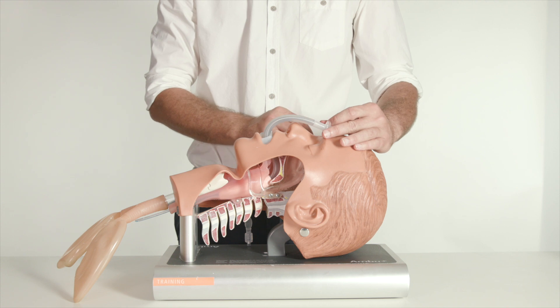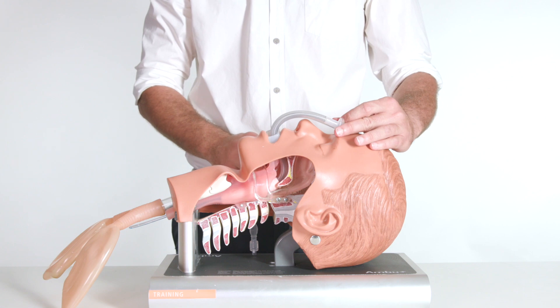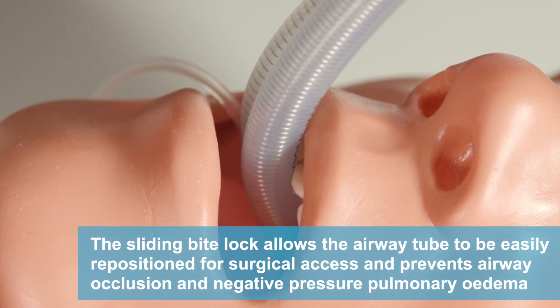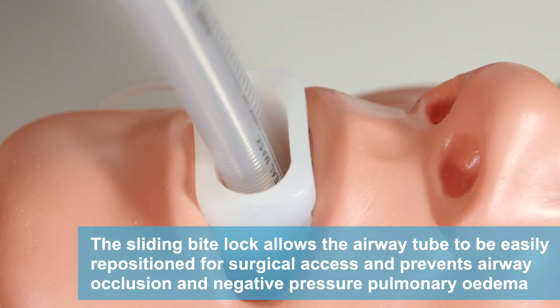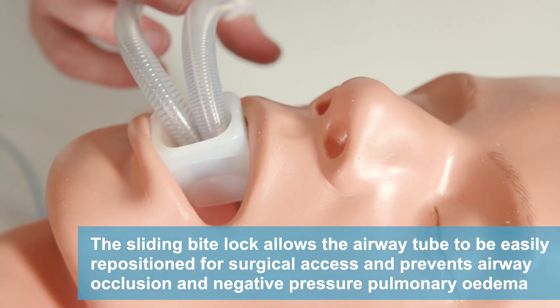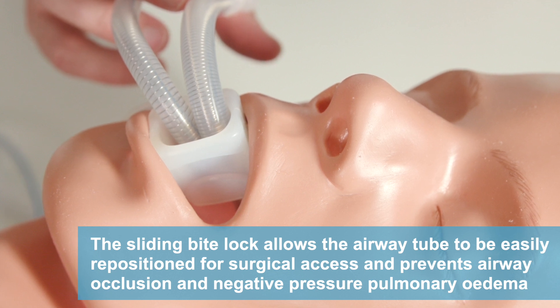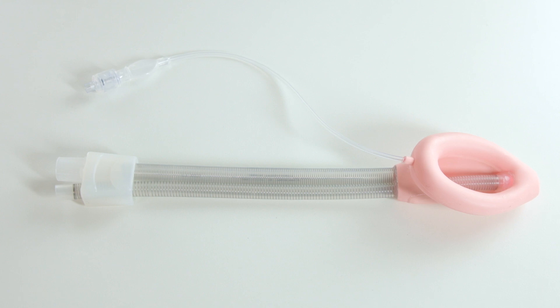The flexibility of the airway tube provides an easy connection at any angle from the mouth. The sliding bite block may be left out of the mouth or placed between the teeth. It allows the airway tube to be easily repositioned for surgical access and prevents airway occlusion and negative pressure pulmonary edema caused by the patient biting down on the airway tube when emerging from anesthesia, with the added benefit of being a single-use device without the sterilization and infection risk of multiple-use devices.